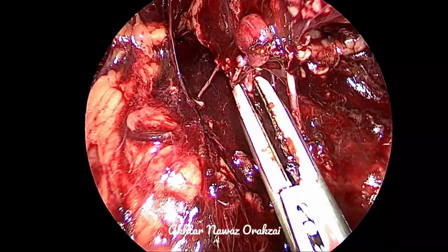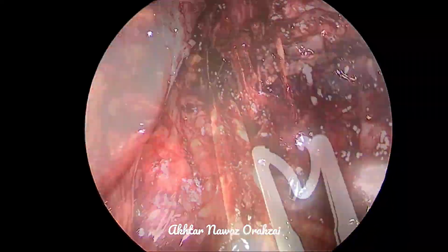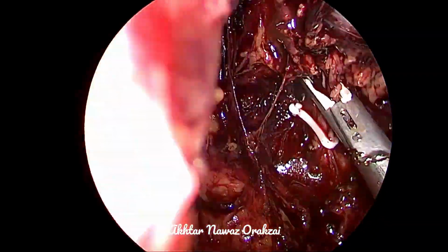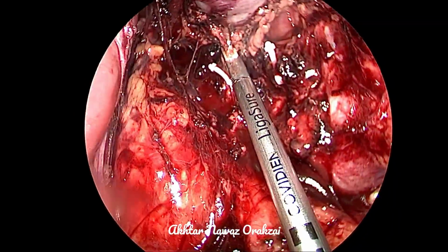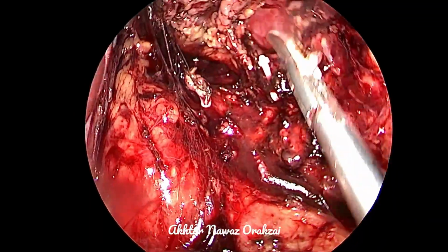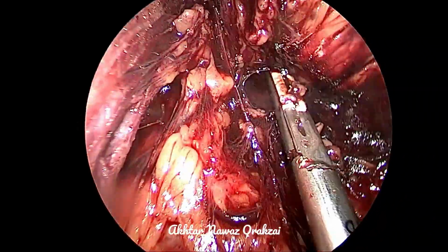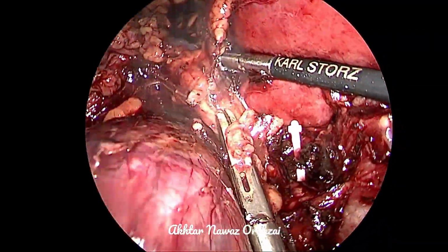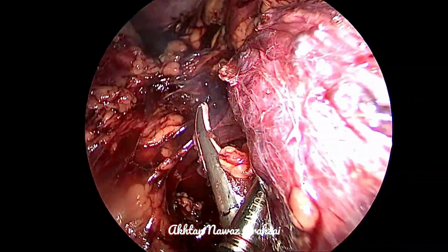So here you can see that there are small arteries. One of them is a bigger one, which is now clearly visible. It is going into the adrenal gland. So we use a bigger clip to clip both the arteries, and then we burn it with the vessel sealer, and then we divide it. And so the gland has now turned pale. All the blood supply to it has been stopped. The congestion is gone, the bleeding is gone, and now remains the upper portion.